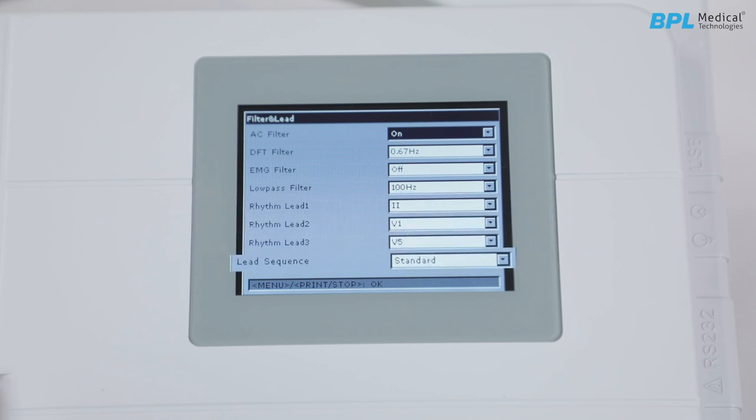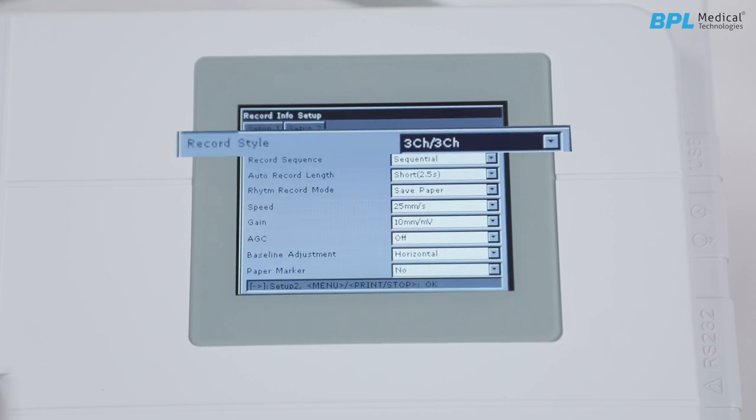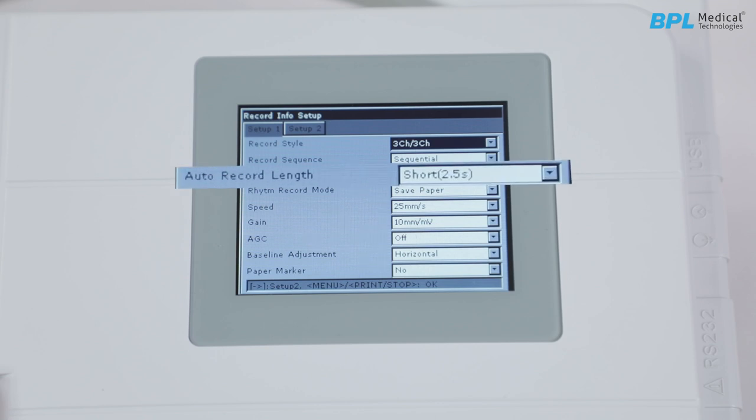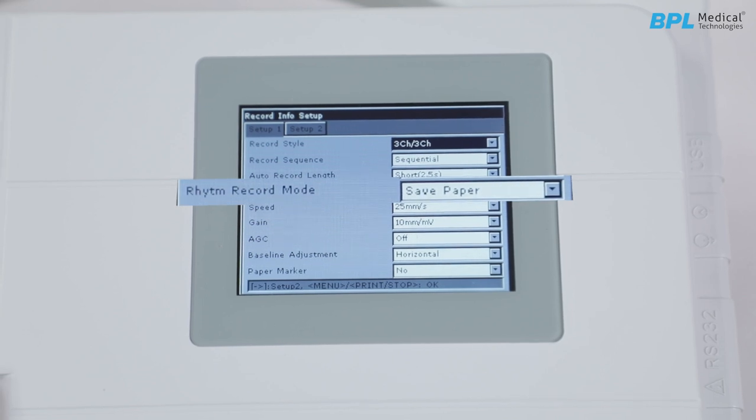Next is the record info setup. Record style sets the print format required for the printout. Then we have record sequence — whether the lead needs to be printed sequential or synchronized. Next is the auto record length, then a rhythm record mode. Save paper prints after sampling 10-second ECG on a single paper; Quick prints immediately but in a detailed layout.